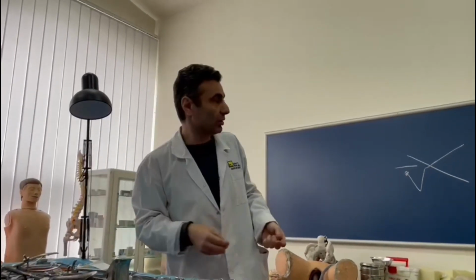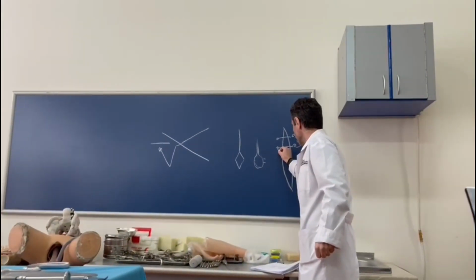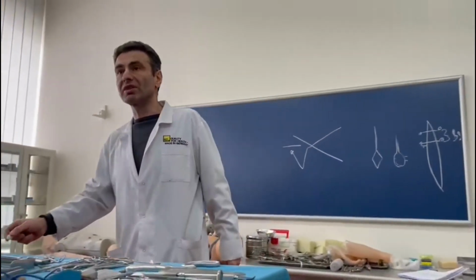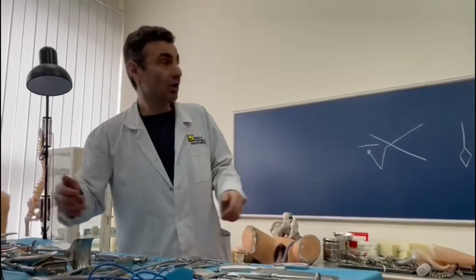That is very important. What about piercing distance? Piercing distance, guys, is the distance between your piercing point and the margin of the wound. Piercing distance also for each tissue is the same for the same tissue, and different for different tissues.